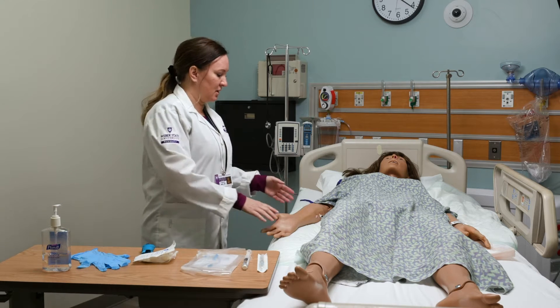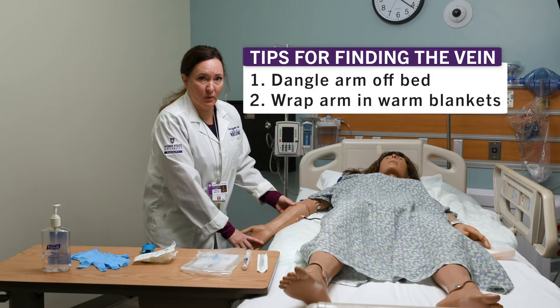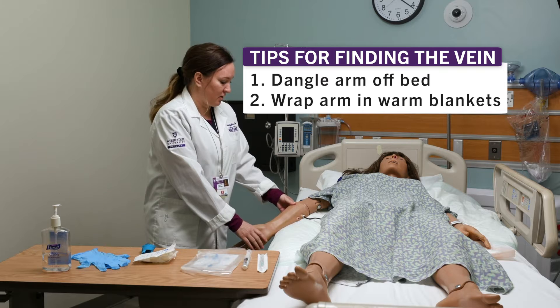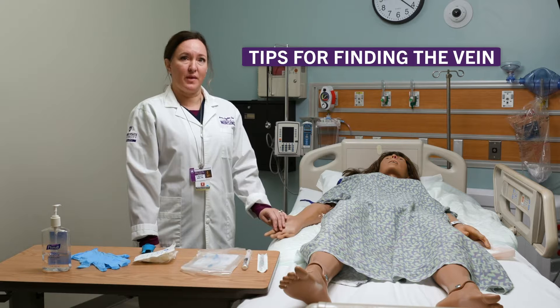If you're having trouble finding a vein, sometimes having the patient dangle their arm off of the bed for a while will really help the blood flow go down into the arm. You can also wrap the arm in warm blankets and try to get a little more blood flow that way.